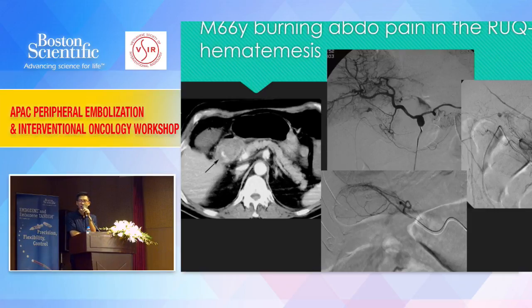Other patient has a medical history of duodenal ulcer. Suddenly has hematemesis, blood vomiting, and on CTA we see the extravasation at the position of the duodenum, and because of the massive active bleeding, we do angiography and see very small extravasation at this point, and more selectively, we see the very small branch come from the gastroduodenal artery to the lesion, and a small branch here come to the gallbladder.